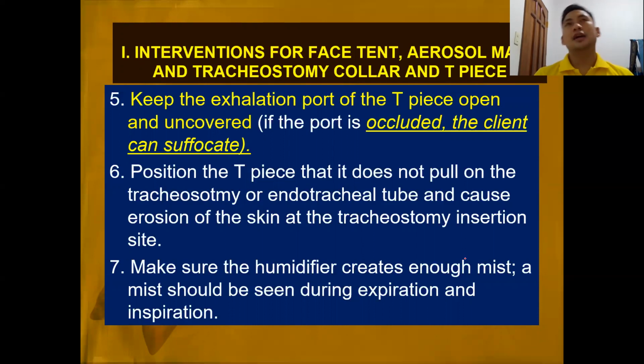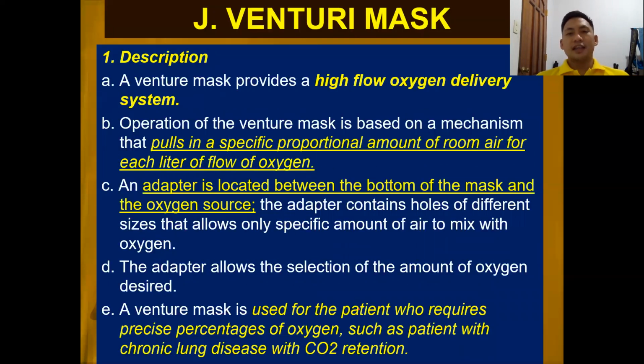Same as with non-rebreather mask. Remember your non-rebreather mask? Wala siyang area wherein the atmospheric air can enter. So kapag may blockage in the exhalation ports as well as in the univalve, in the reservoir bag, it would suffocate the patient. So you have to check for possible kinking or blockage in these ports. Make sure the humidifier creates enough mist. A mist should be seen during inspiration and expiration.